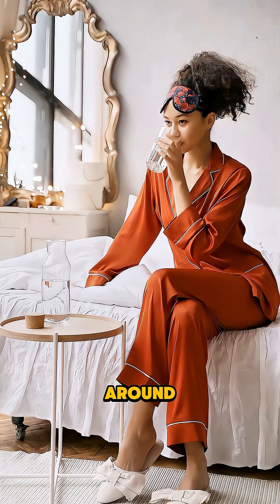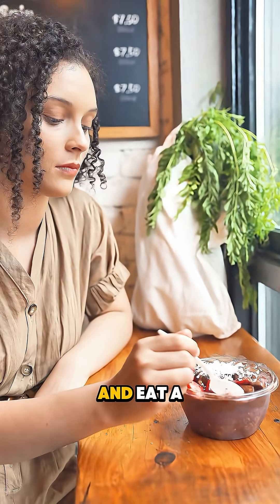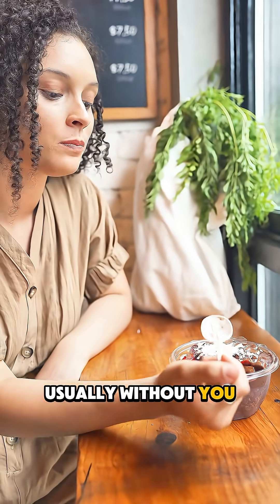During this time, you can walk around, drink clear liquids after a few hours, and eat a light meal later in the day. The capsule is disposable and passes naturally in your stool, usually without you even noticing.